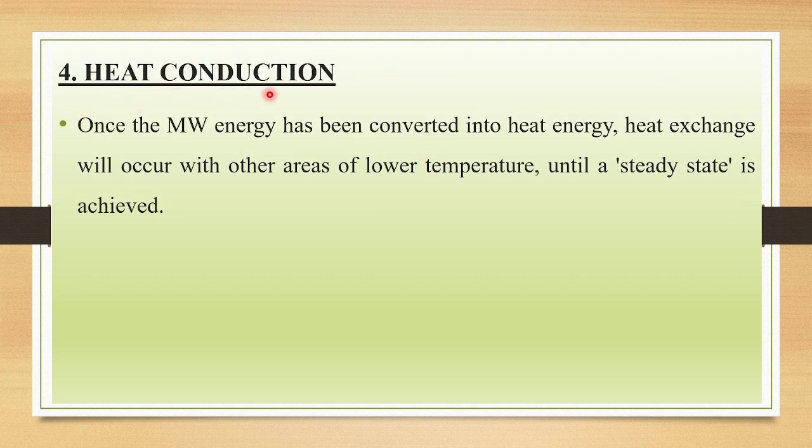The next physiological effect is heat conduction. Once the microwave energy has been converted into heat energy, heat exchange will occur with other areas of lower temperature until a steady state is achieved.